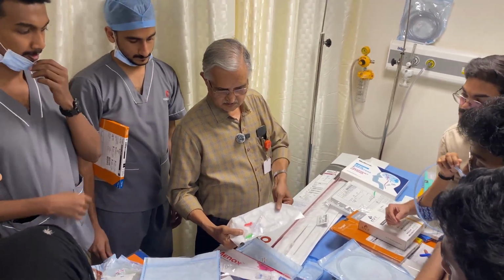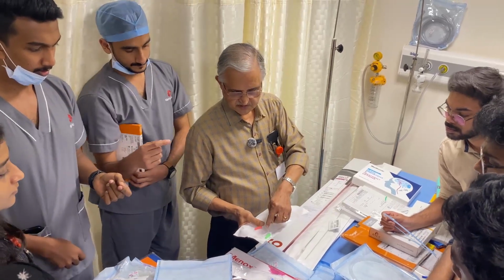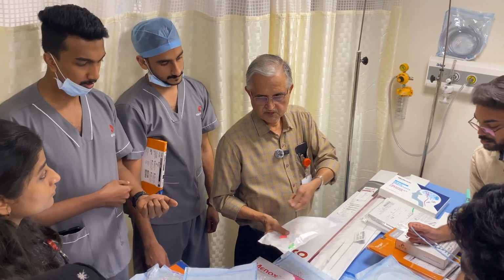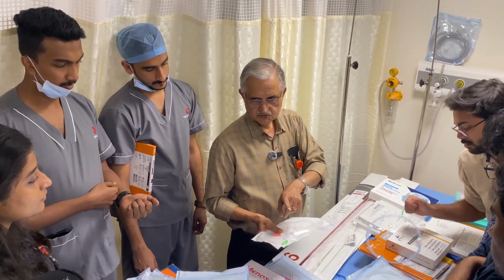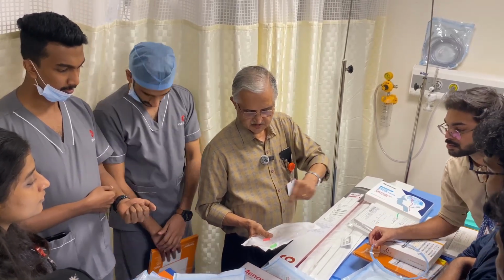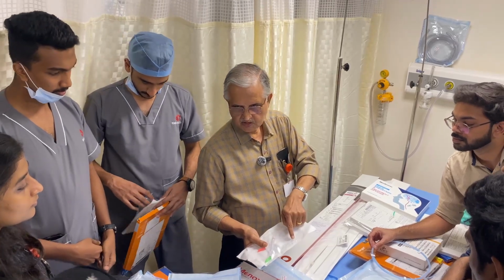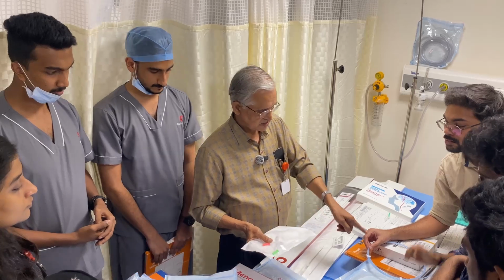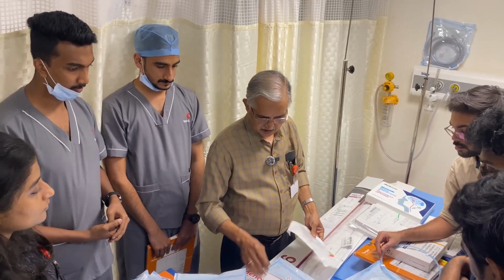The needle is used to introduce it. If you just push this wire inside, especially with a backflow, you will not be able to push it in and that wire may get damaged also. Its straightness may be lost and it may sometimes kink or become like a spring. So to avoid that, use a longer needle. You put the needle inside and through that you introduce these micro wires.